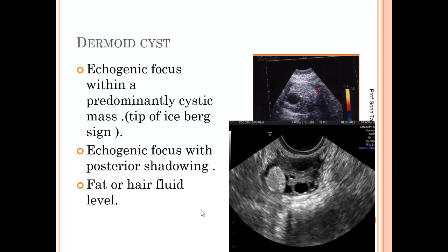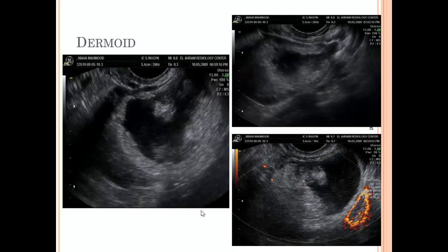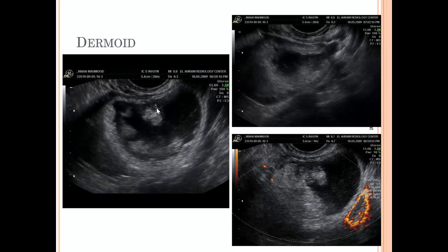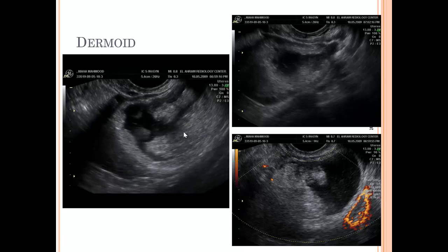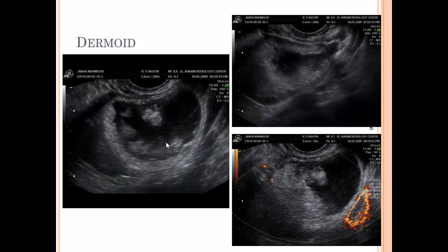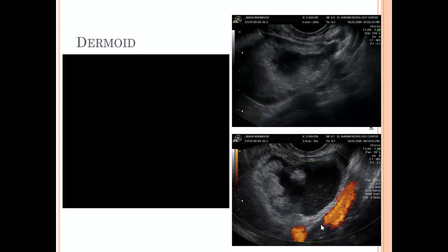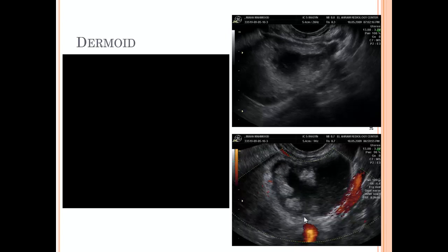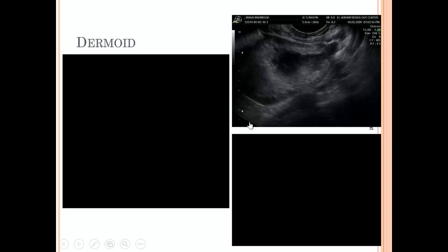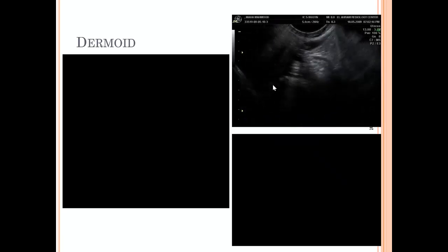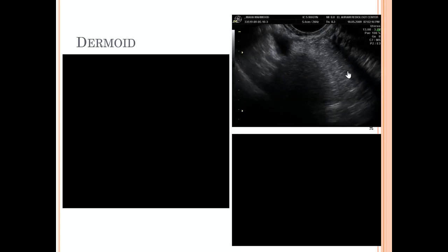Here is another case of teratoma showing the thick wall, echogenic floating parts within the cyst, and many echogenic floating particles. The rest of the cyst shows fine echoes. On color Doppler, the thick echogenic wall and echogenic particles inside are completely avascular. Note bilaterality — this is one on the left side, this is the uterus, and another one on the right side. This is the tip of iceberg sign, sometimes also called the ghost shadow.